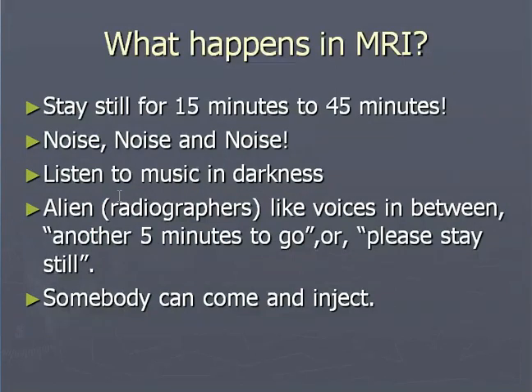Now, what happens in the MRI? Or in other words, how is the MR performed when the patient is inside the magnet? The patient has to stay still for 15 minutes to 45 minutes. Noise, noise, and noise. This is due to the gradients which switch off and on, and they produce a lot of noise.